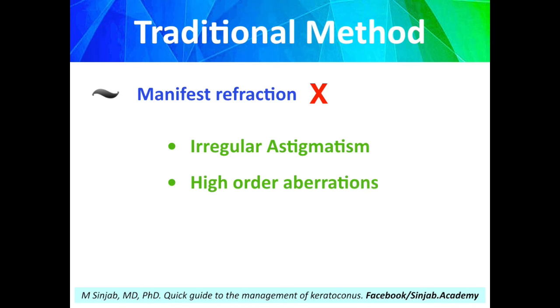And we have to put in mind that the field of action of the intracorneal rings is in the cornea. So we have to consider the refraction of the cornea itself. I mean by that the topographical astigmatism.